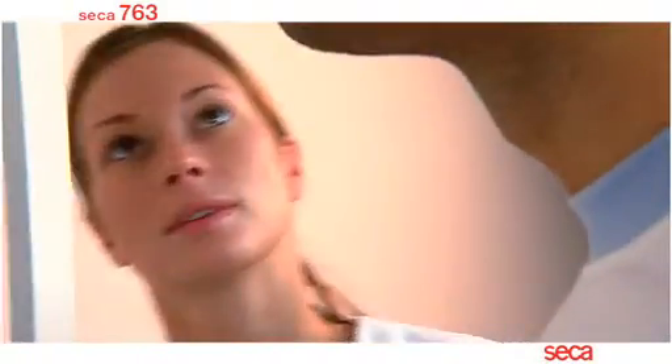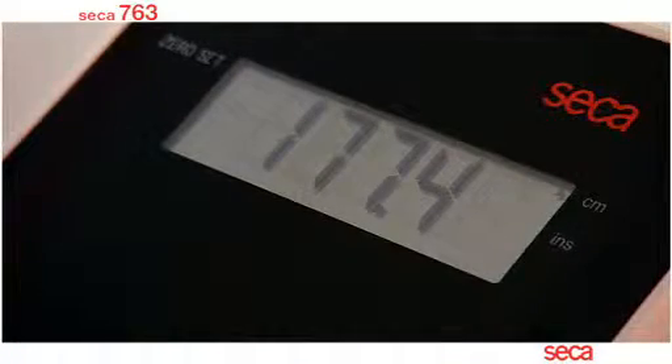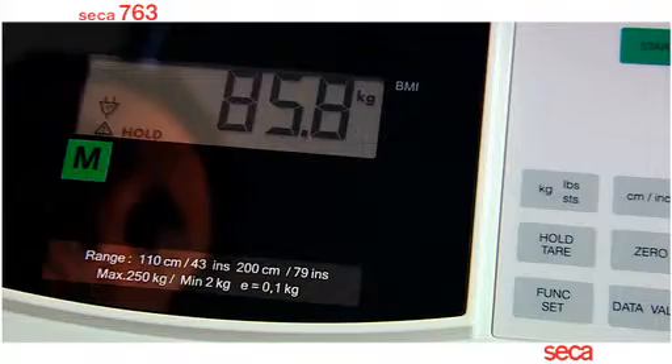The correct height of the patient is important, as both height and weight measurements will be used by the Seeker 763 to automatically calculate the body mass index.